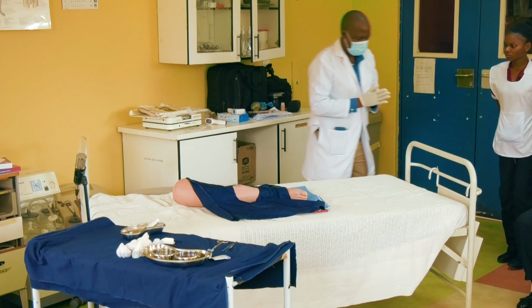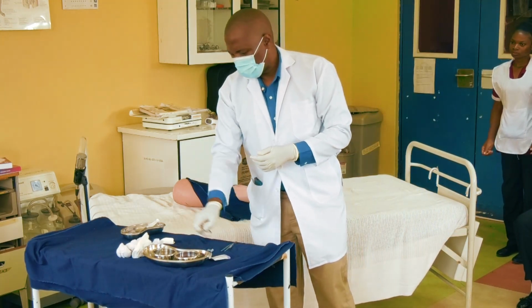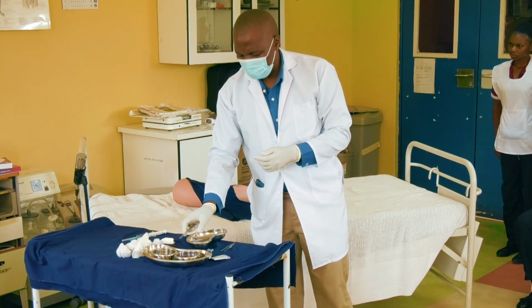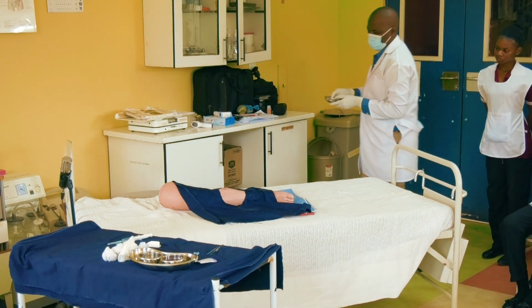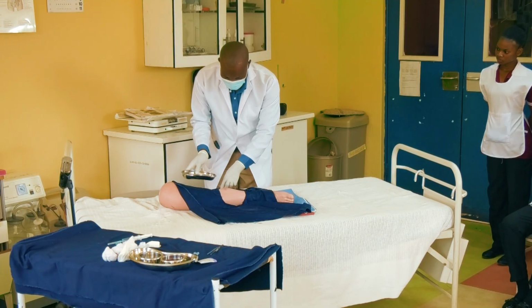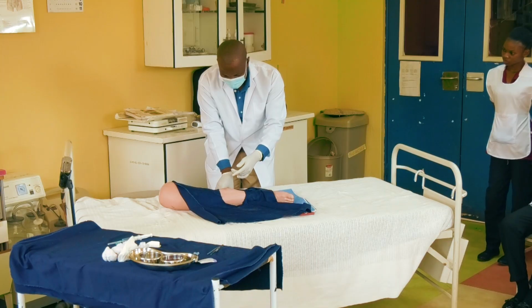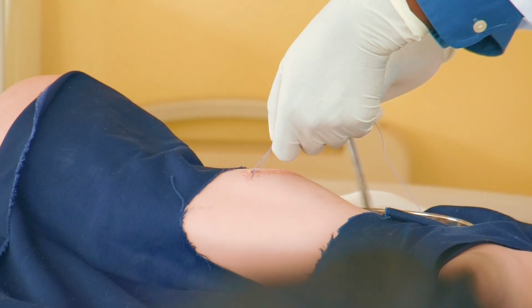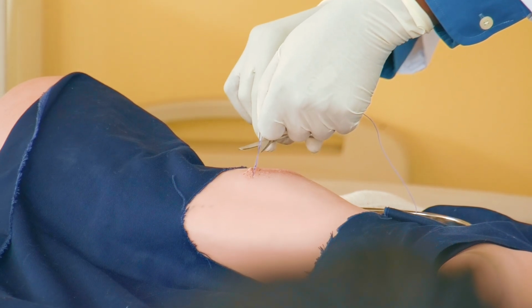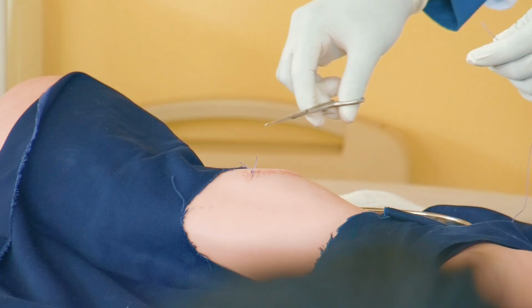Let me pick. Because now it says, if you were somewhere, you would have your assistant cutting for you, but this is your procedure. You are just with the assistant who hasn't scrubbed, they can't hold anything. These are supposed to be here, but for the sake of demonstration, so that you see, that's why I'm doing this. Then this should be at least not that long, not that short, because remember, suture removal also is another procedure. You need this, right? When removing. Okay? So one is done.